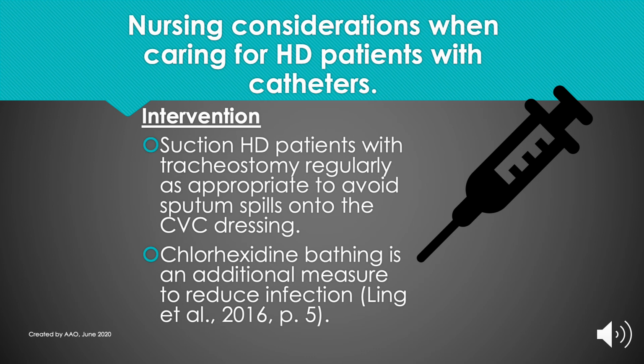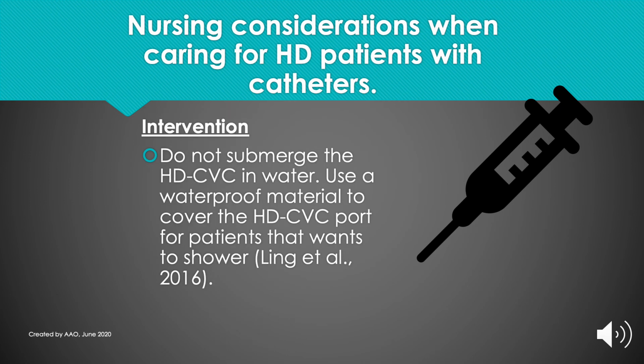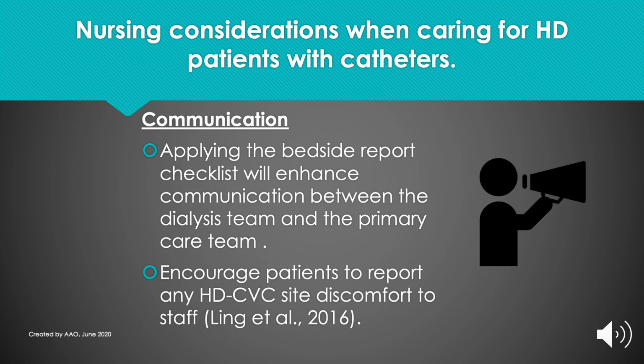Chlorhexidine bathing is an additional measure to reduce infection. Do not submerge the HD catheter in water. Use waterproof materials to cover the HD CVC port for patients that want to take a shower.